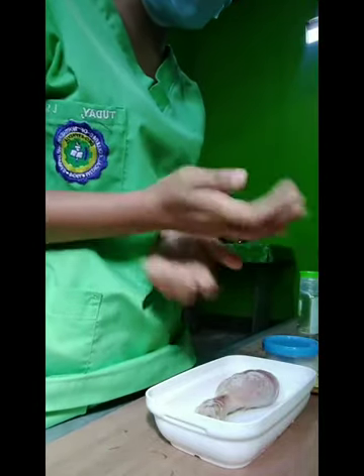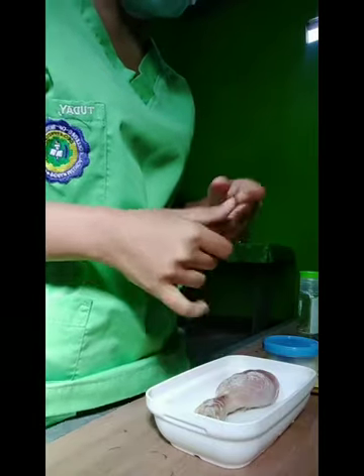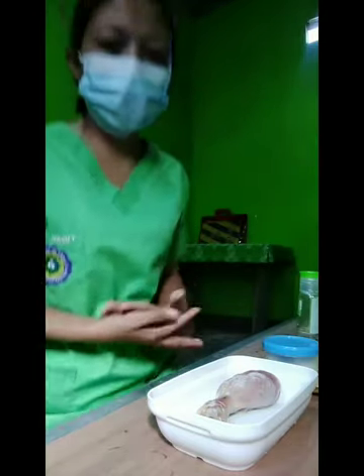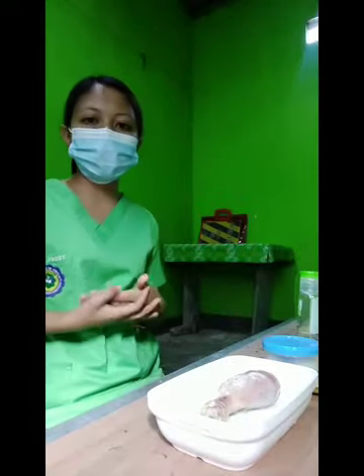Observe the area for signs of erythema at determined intervals after administration. Inform the patient of the need for inspection. Then last, document the procedure. And that's all.